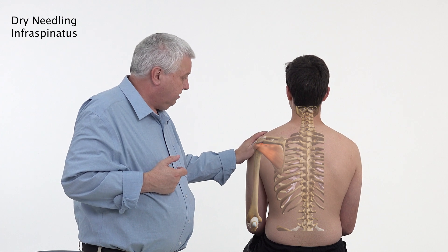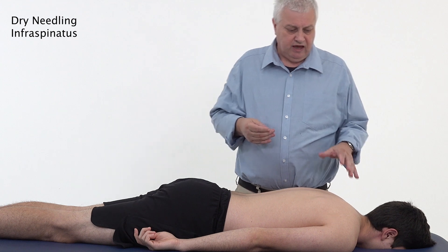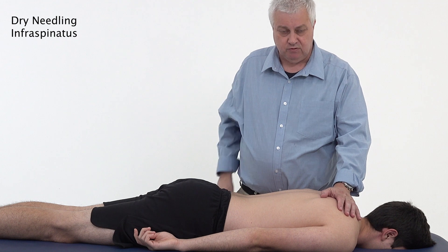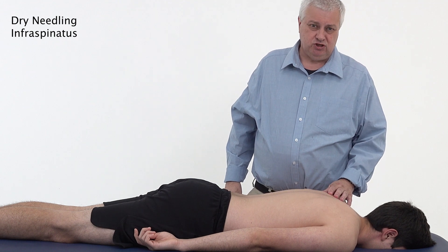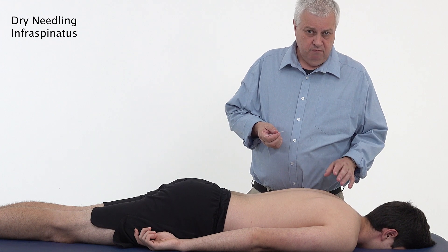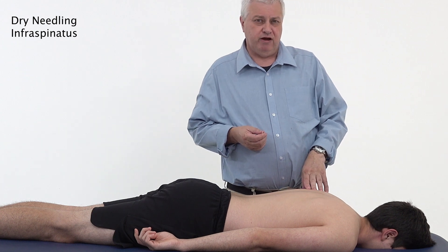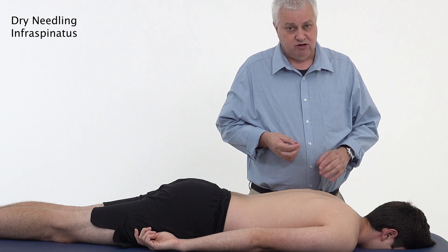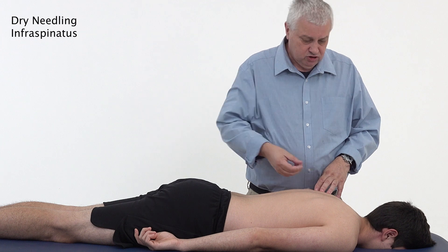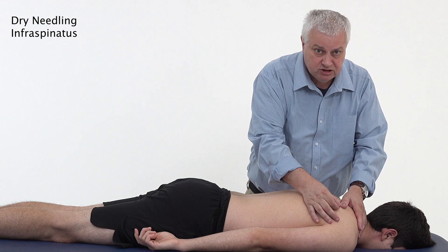For infraspinatus needling, we need to get the patient to lie on their front, though you can also do this side lying with the patient lying on the uninvolved shoulder, similar to supraspinatus. Prone is preferred as the patient is usually more relaxed. You can use up to a 30 millimeter needle. Be careful not to go straight down in a posterior to anterior direction, because if there are any fenestrations - little holes in the scapula - you could go through. Use a tangential angle to ensure complete safety.